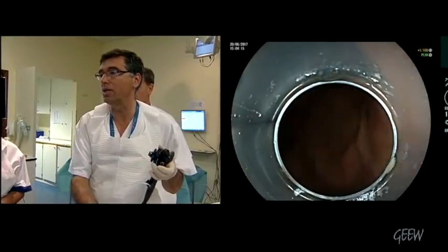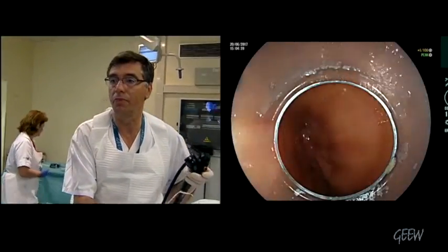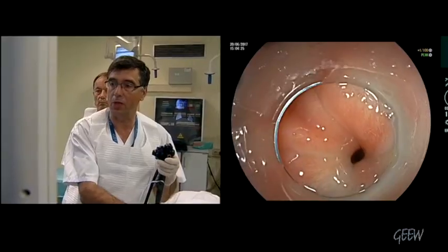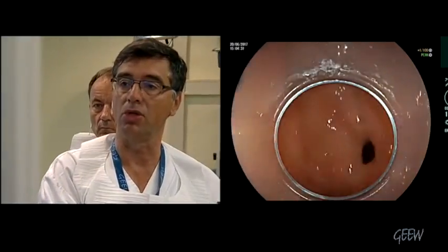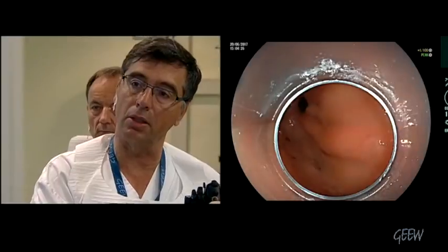We are going down into the antrum towards the pylorus, which is there with the spasm. I cannot pass and I don't want to try, to avoid inducing any inflammation. This is a pylorus spasm.